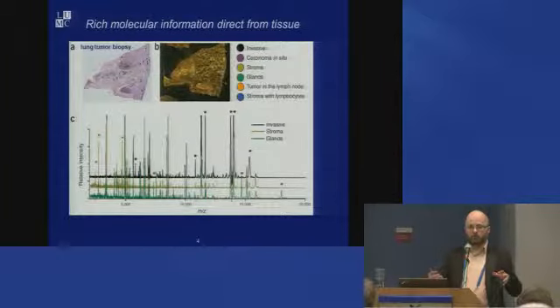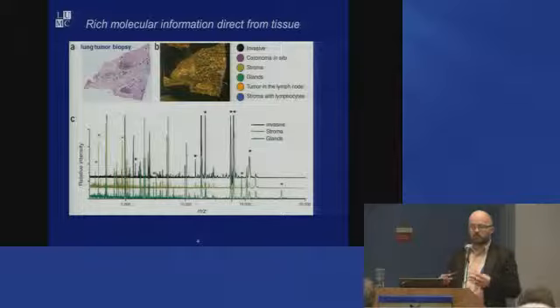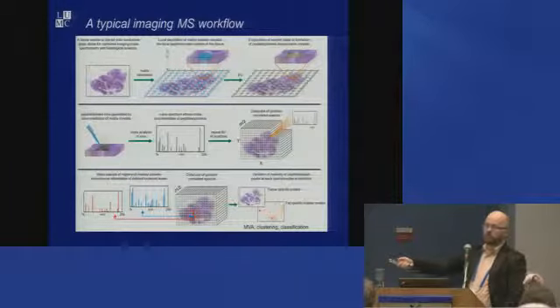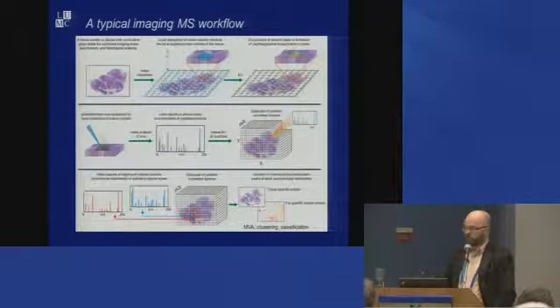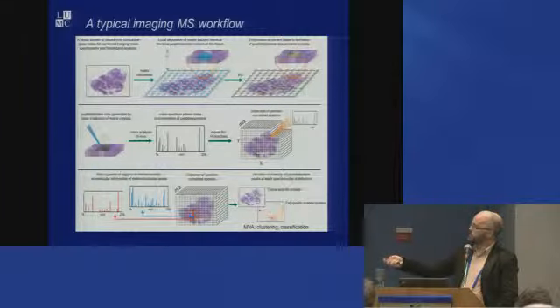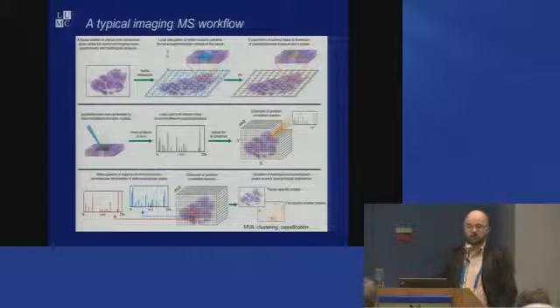So what's a beautiful thing, one of the real strengths of imaging mass spectrometry, is that you can integrate it quite seamlessly with histology. This is actually histology defined, say, protein profiling. It's not imaging. Imaging is actually, instead of analyzing selected parts, it's actually just analyzing the entire tissue with a sort of a spatial array of spots.